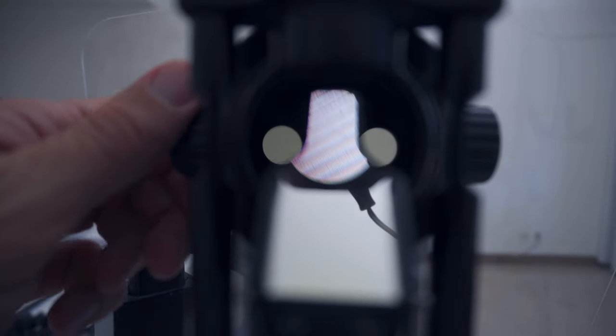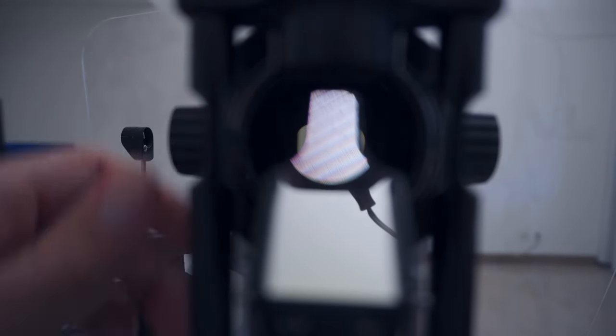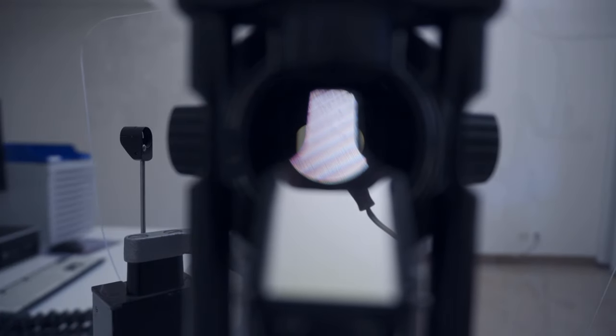But putting your eyes closer together now creates a new problem. The mirror is in the way. To solve that you need to move your mirror to the side by one step.